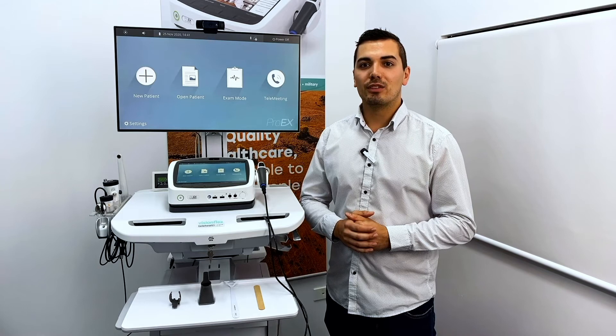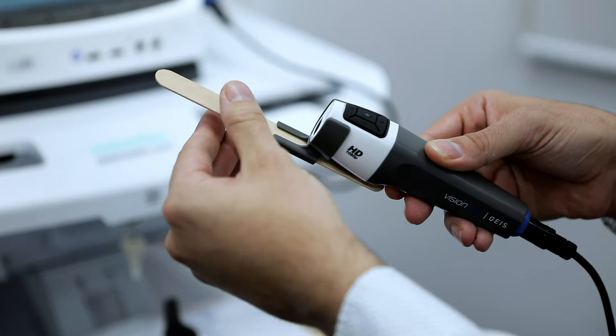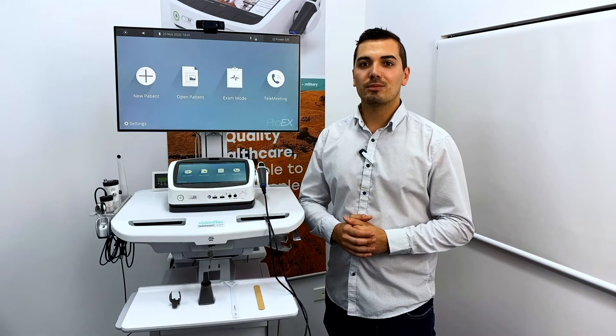The GEIS camera has the added advantage of adjustable LED illumination. The tongue depressor easily slides in and out of the attachment should you need to change the length.